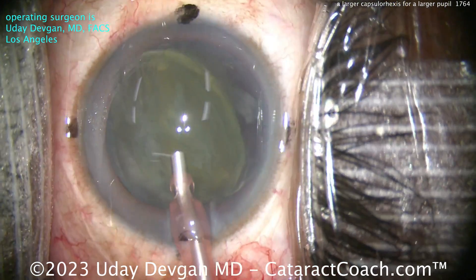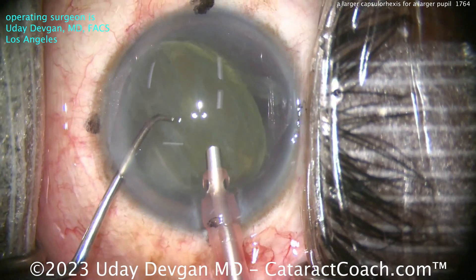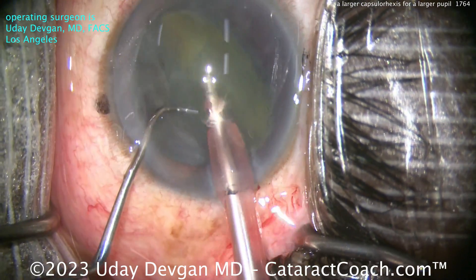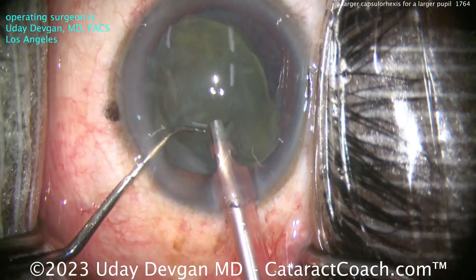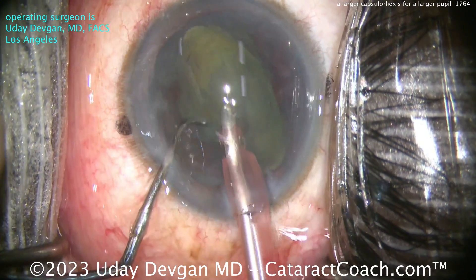There's the nucleus — not too dense. It was mostly cortical changes here, so this will be emulsified relatively easily. We'll feed that over into the phaco probe. There's the chopper — I don't even have to chop it. You can just tilt and tumble. Credit to Dr. Lindstrom for developing that technique, the tilt-and-tumble technique. You can find that on cataractcoach.com.